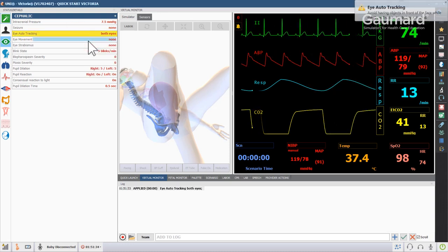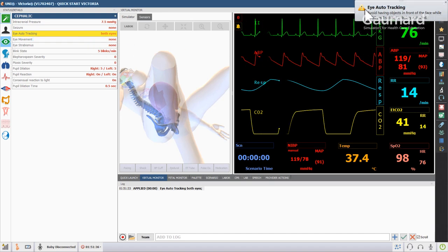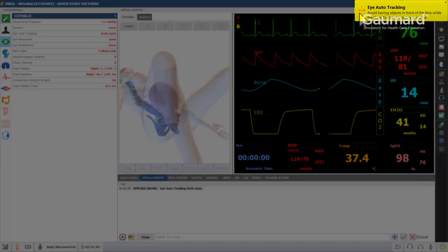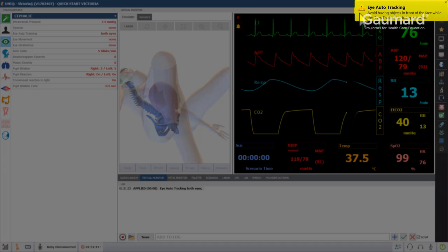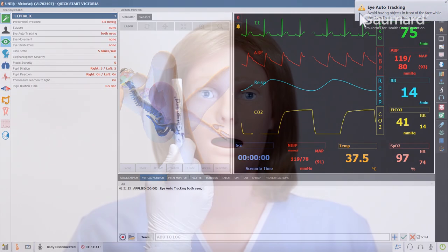Victoria's eyes will track pens, fingers, and other stimuli horizontally, 6 inches from Victoria's face. When the feature is activated, Victoria will automatically adjust to the ambient space in front of her eyes and forehead.